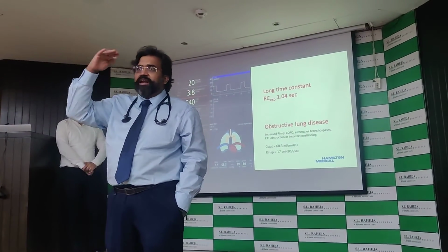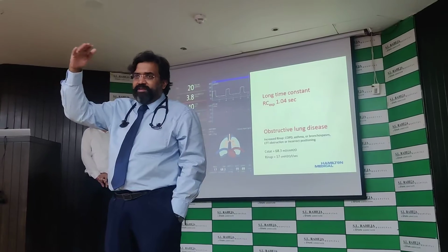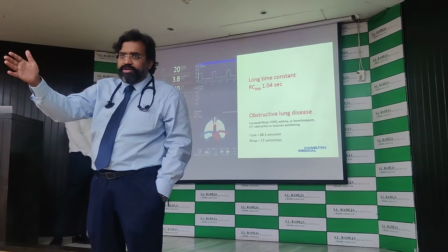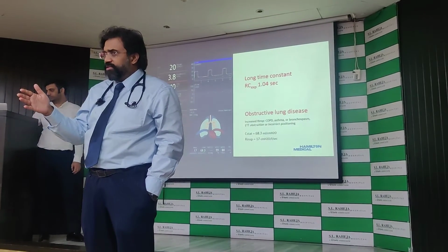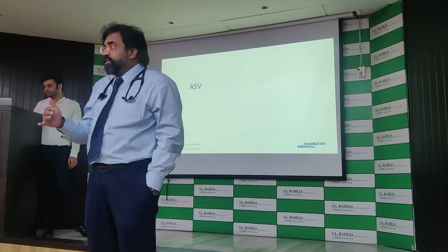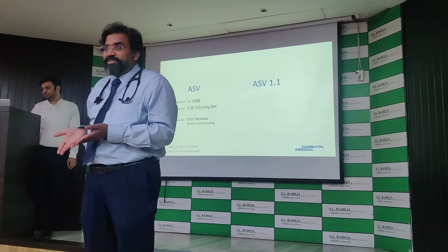That's why on the evidence pyramid, tidal volume comes first. On the evidence pyramid, low tidal volume ventilation comes first. Because that we know for certain is very clear that it increases, that there is a problem. Plateau pressure comes down on the evidence pyramid because this is the problem with plateau pressure.